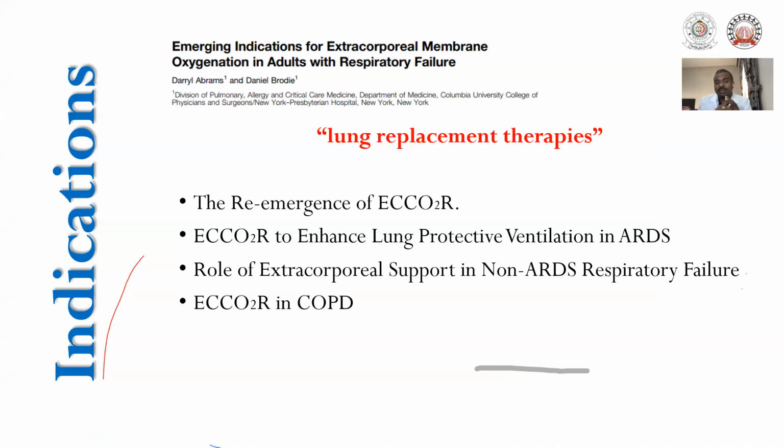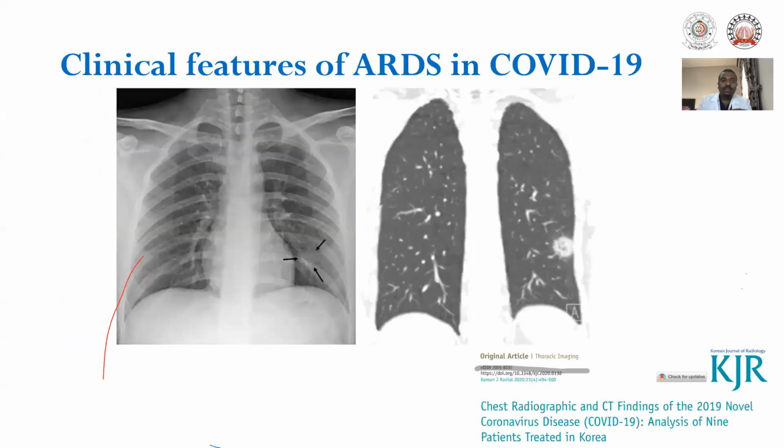We all know that the low volume, low pressure ventilation strategy has been shown to improve survival rates. Most of the time, we RTs have to sacrifice the lung protective strategies as a result of low compliance and unacceptable pH levels. By directly removing the carbon dioxide from the blood, ECMO could permit lung protective ventilation in these patients by maintaining pH at low tidal volumes.